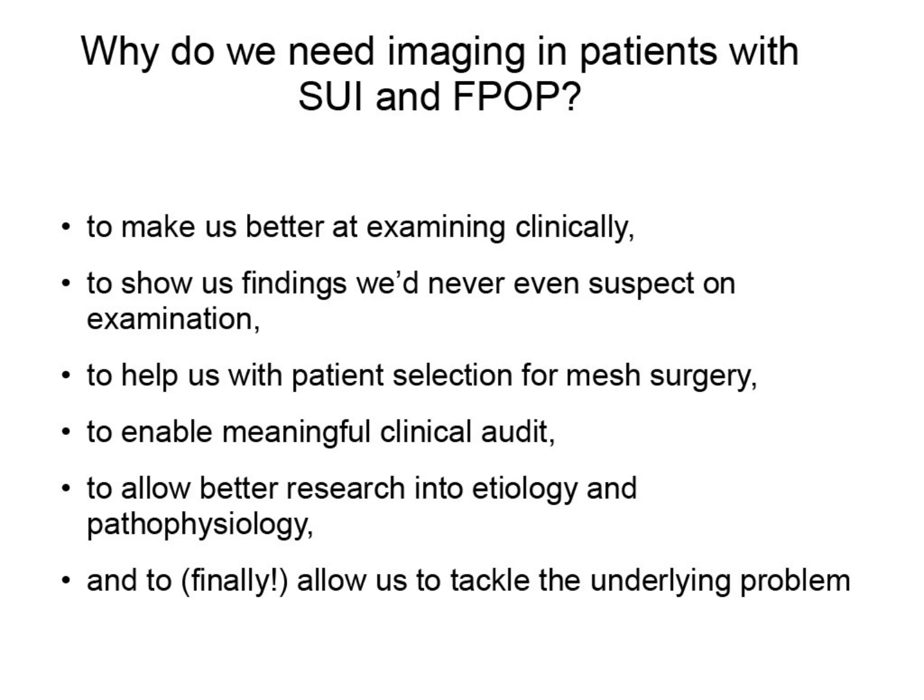When it comes to examining the levator for avulsion, I reckon by now I'm as good with my finger as I am with the ultrasound machine. But it takes a long time. It is a skill that has a substantial learning curve. On imaging, we can teach anybody within a week. Anybody. And the reason for that is that our eyes are our primary sensory organ. It's not our fingertips. It's easier to teach our eyes.